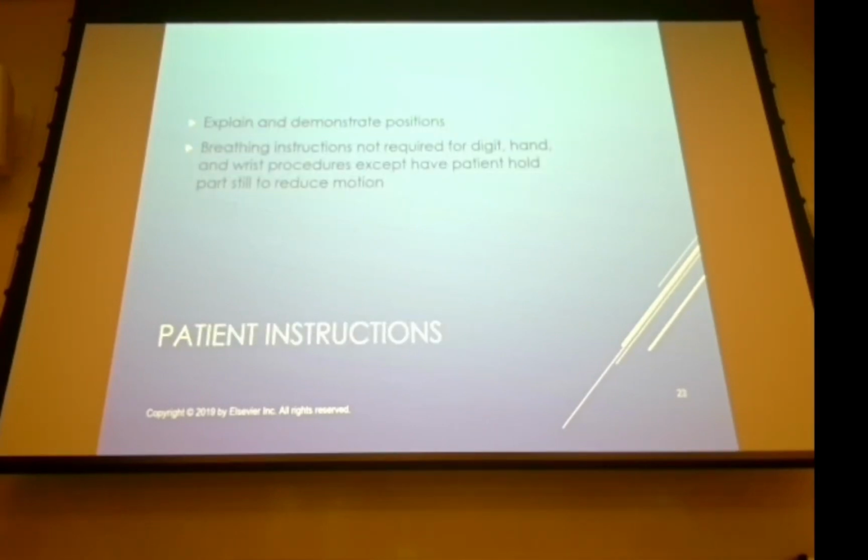Radiation protection primarily is going to be your collimation. So I think most of our hospitals still tend to shield the patient, right? So still tend to put an X-ray gown on the patient. I think that's still protocol, but industry standards are kind of making a shift, and I expect that the recommendation for shielding is going to go away in most cases.